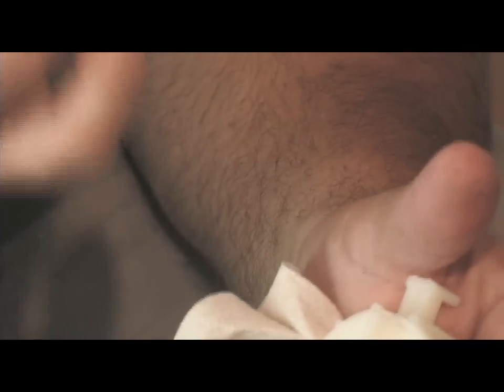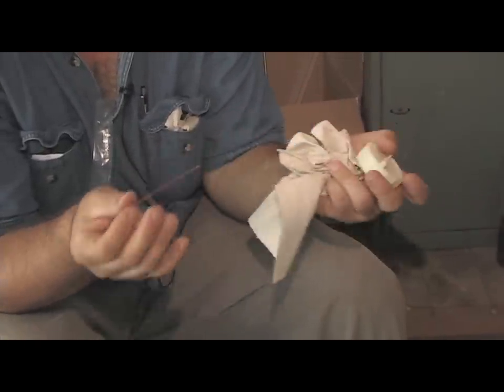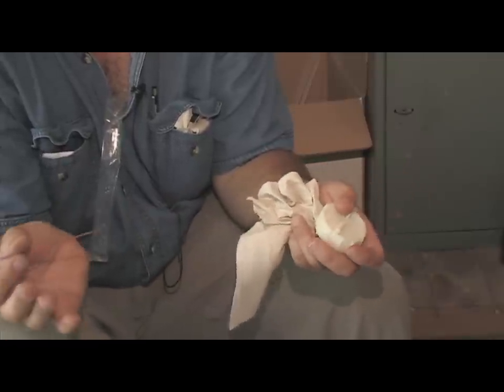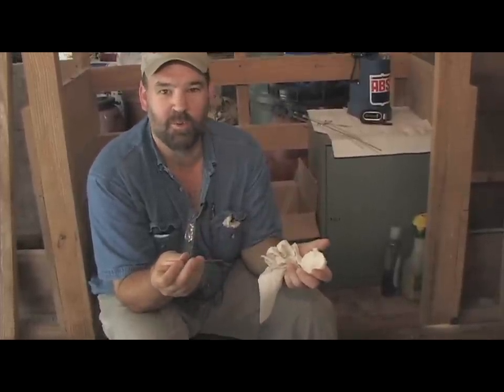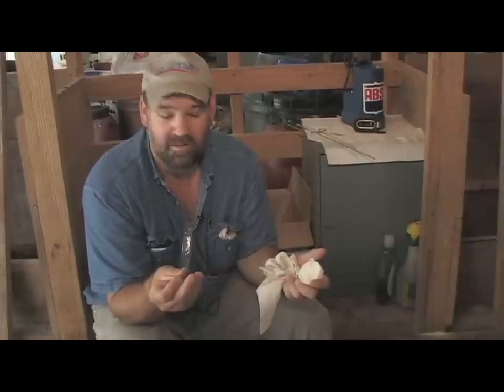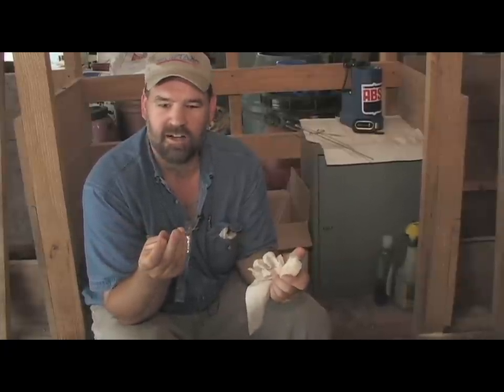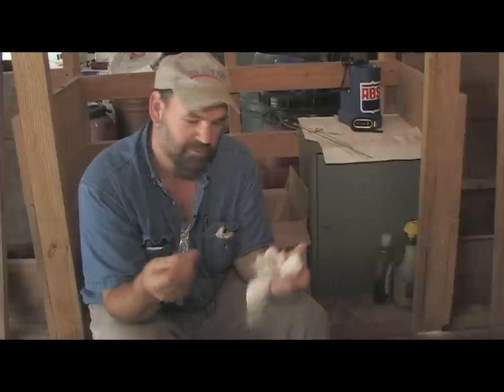Put the open end — the end you cut off — into the sheath first. I've made all these mistakes and wasted quite a few straws learning, mostly because I'm nervous. I've got cows over here stomping around. I don't have a real nice chute — I don't have any chute. I'm laying stuff on the ground trying to keep the cows standing in one place. So just don't be nervous. Read about it really well, maybe go over your notes. I don't do this but once every three or four months. But I did four cows in the first year and I think I used seven straws and three of the four took, so I'm pleased with that. That one I just did, she took the very first time I ever tried it.